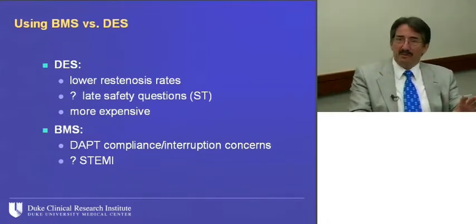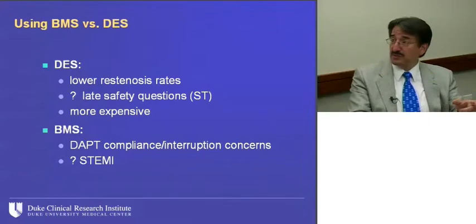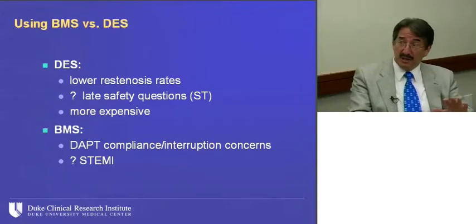Bare-metal stents, I think, our primary use is still in the setting of patients who we feel are unlikely to be compliant with medication, dual antiplatelet therapy, or are at risk for a physiologic reason to need to interrupt. They have a history of bleeding or stroke, or they need surgery, which is predictable, and we understand they're going to need their dual antiplatelet therapy interrupted. By and large, that's the selection ground, and that pre-procedural triage now I think is much more rigorous and is what sustains this 20 to 25% of patients who we start with bare-metal stents.